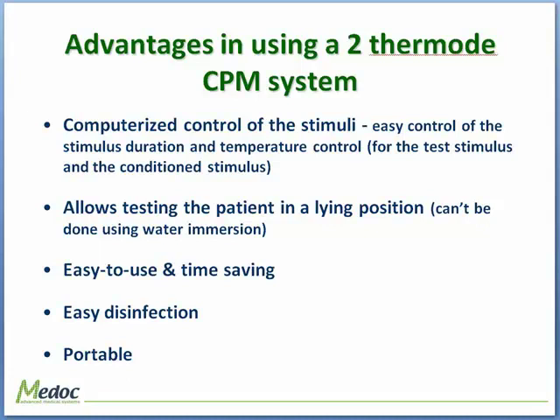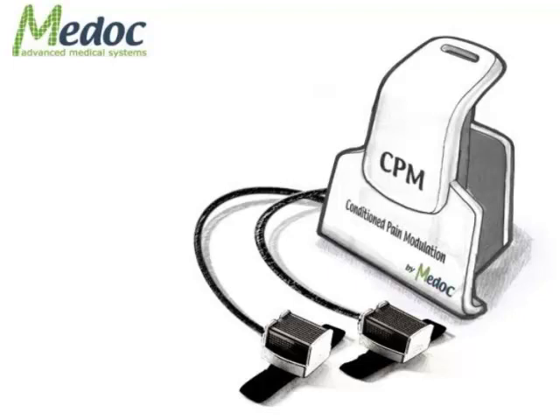Another advantage is that when using a bath, it's also computerized, but we don't always know, especially with cold water, what exact temperature we're actually applying. Here we're talking about a computerized system where you decide the temperature to give, how long it stays, and you choose the parameters. It's easier to choose and change the parameters than with baths, which is more complicated. So it's more convenient for the person performing the test. It certainly has advantages.